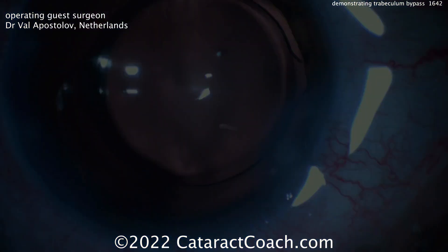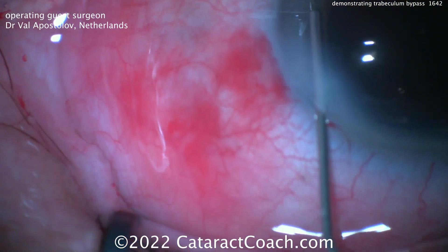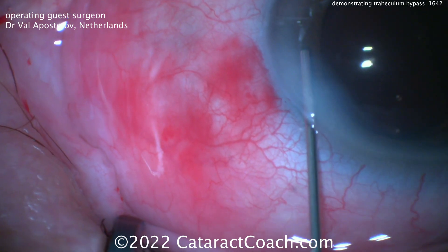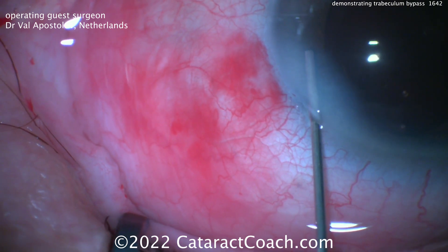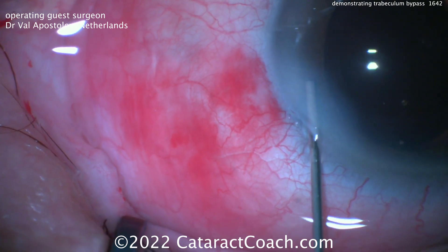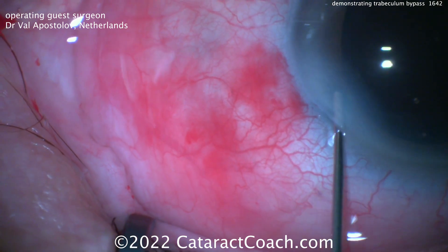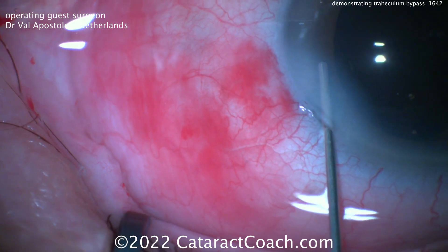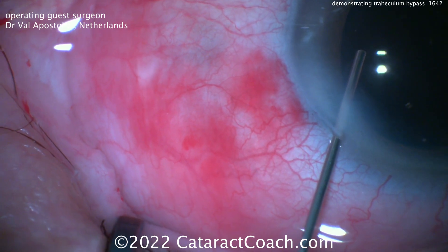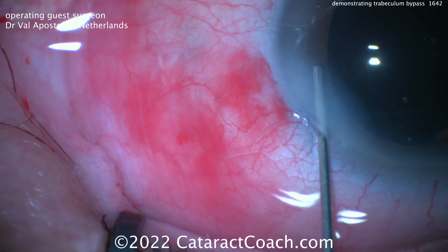Remember, just doing cataract surgery alone actually will lower the IOP. Think about it — you're replacing that thick human crystalline lens, which is often four and a half or even five millimeters thick, with a very thin IOL of about a millimeter or so in thickness. As a result, the angle of the eye tends to open up, and it certainly fixes any issues of narrow angle just by doing cataract surgery. In addition, you may get an increase in fluid flow and therefore lower IOP. All cataract surgery patients, whether or not they have glaucoma, tend to get an IOP benefit from cataract surgery alone, and doing a MIGs procedure on top adds even a little bit more.